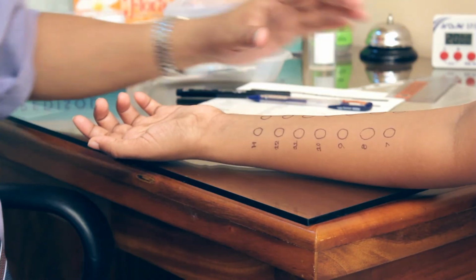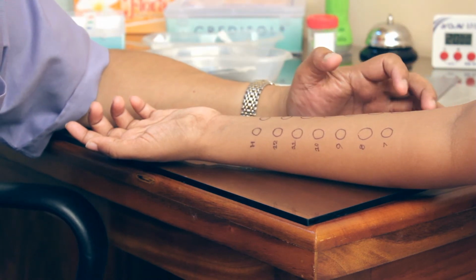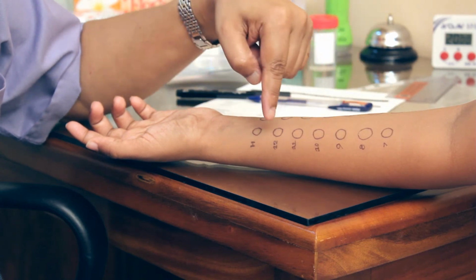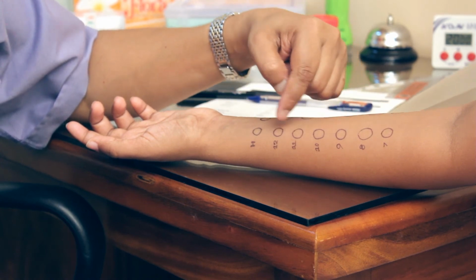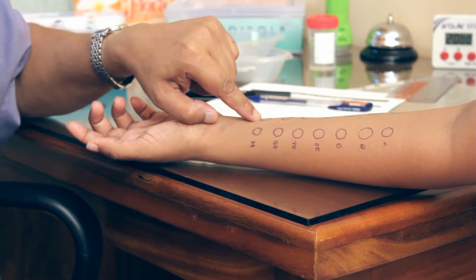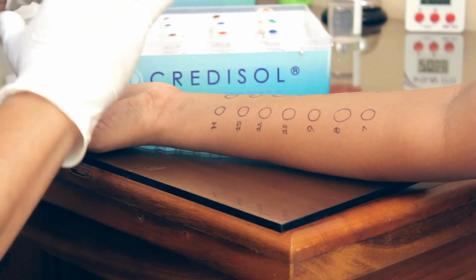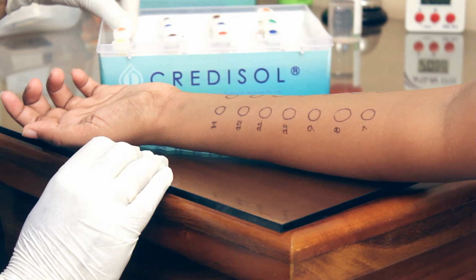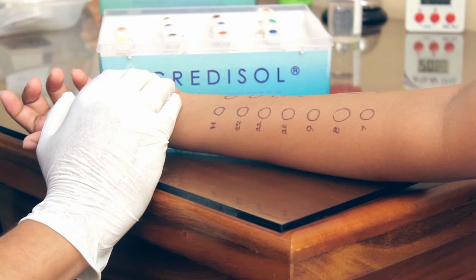So you can see, since we have selected 12 allergens to be tested in this patient, the circles have been numbered from 1 to 12. And then we have the histamine control as well as the saline control. During this procedure it is very important that you place the correct allergen in the correct mark.